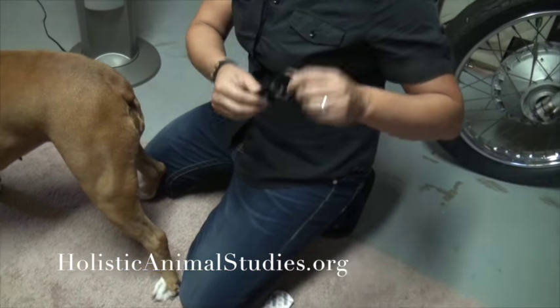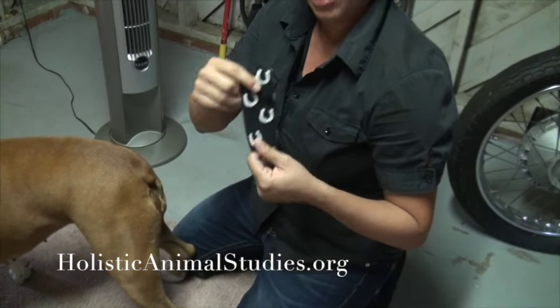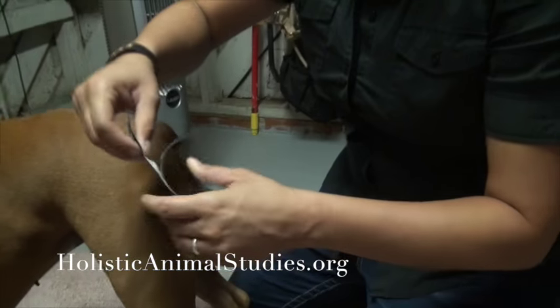We're going to start off using the horse tape. It's made for horses, but it's a little bit stickier, so it works well with dogs too, especially when we're taping the joint area. So I cut it into a Y.